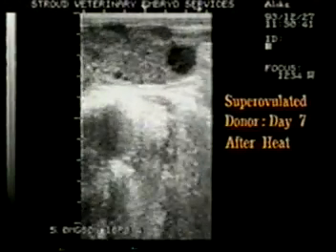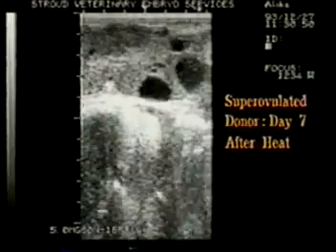Seven days later, on collection day, the ovaries have responded typically by having some unovulated follicles, some completely luteinized CLs, and some fluid-filled CLs. The CLs are outlined in blue.